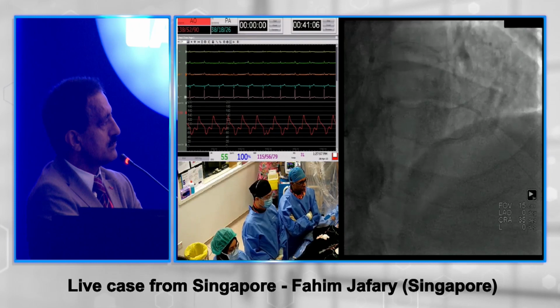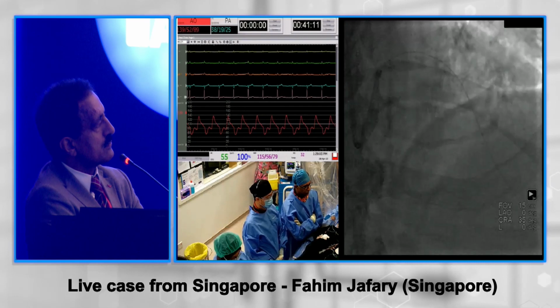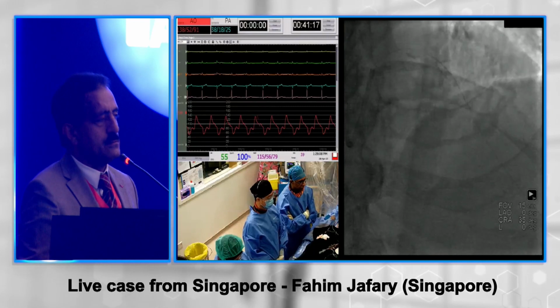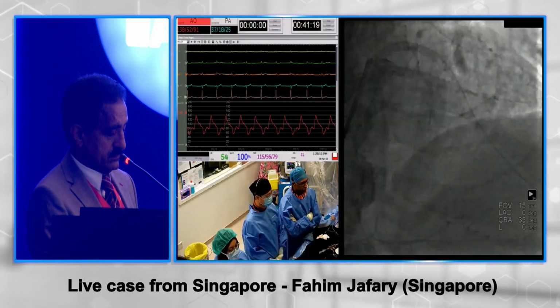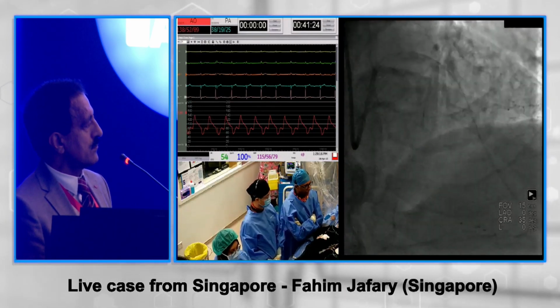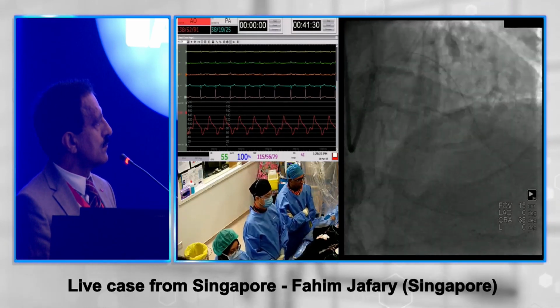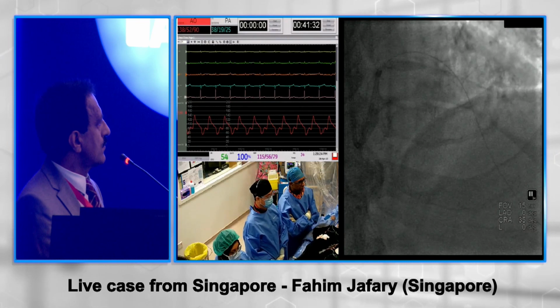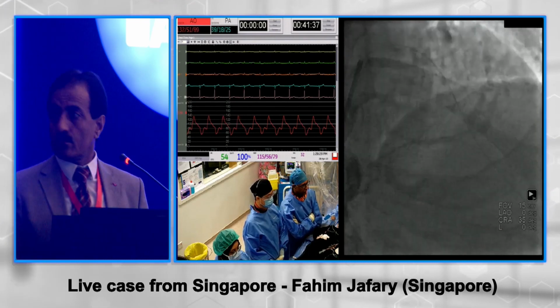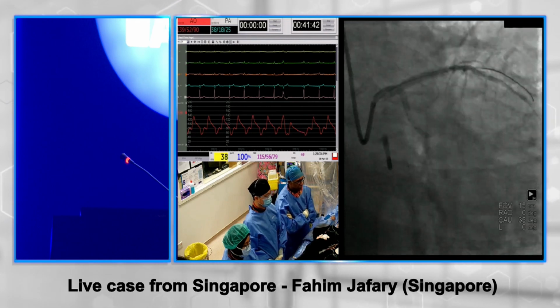And here's when things started to get interesting. We had him in the lab. He has a history of COPD, and we had him on with the help of our Dr. Chunwei Wong, who's our cardiac intensivist and is gratefully helping us with this case. We gave him sedatives, and pretty soon after that, he became really agitated and essentially started retaining CO2. We were worried that we had done some mischief. The angiogram after rotablation looks pretty good. There's no perforation. In the next view, you can see that the left main is okay.